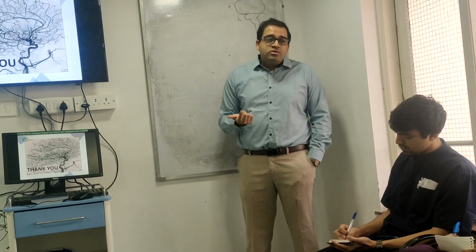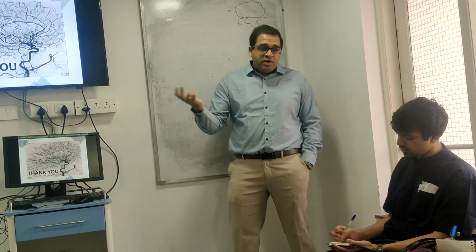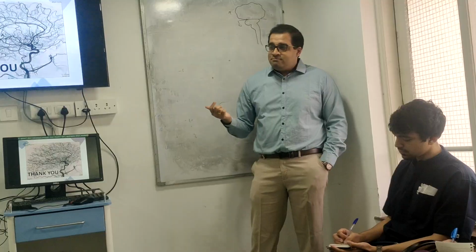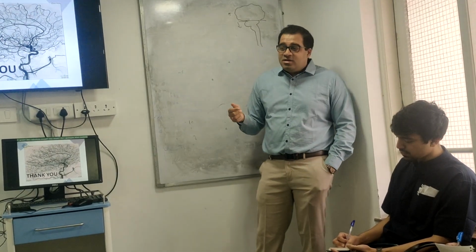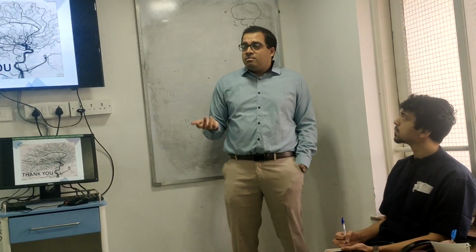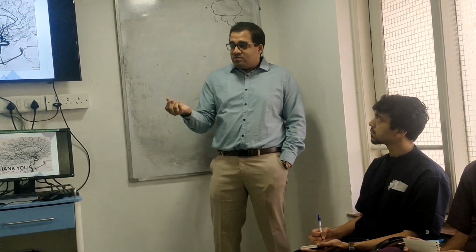मैं सिर्फ aerobic भेज सकता हूँ. Why to waste 10 ml of blood? Anaerobic sepsis होता है नहीं होता? What is it? It is common. It doesn't get picked up on cultures. Anaerobes are very poor culture growers.